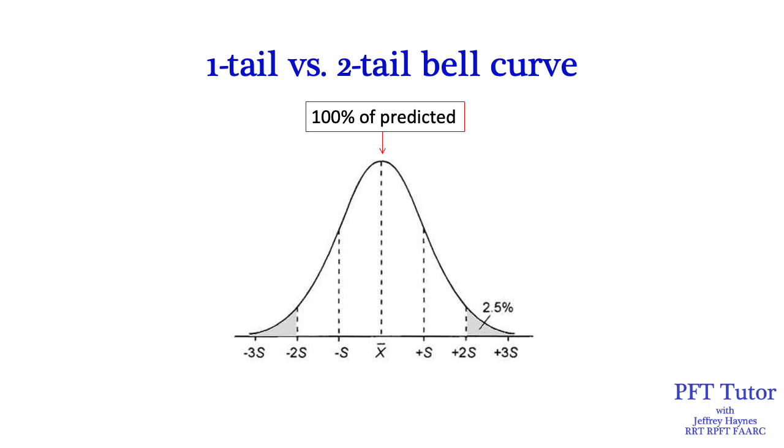There is a 5% error because the empirical rule states that under normal conditions, 95% of repeated measurements will fall between 2 standard deviations of the mean.